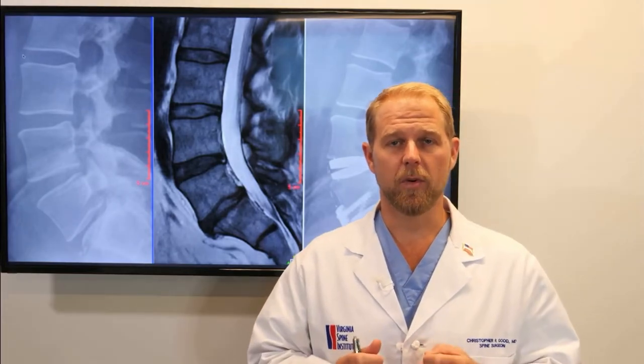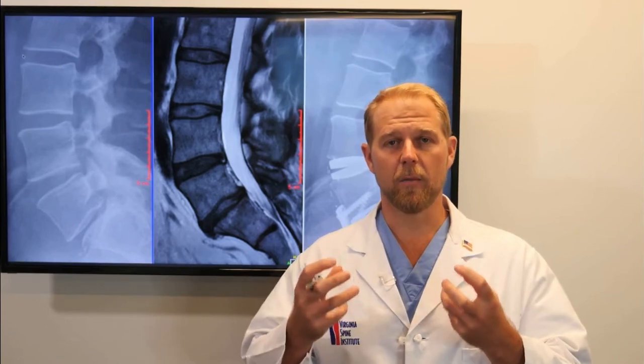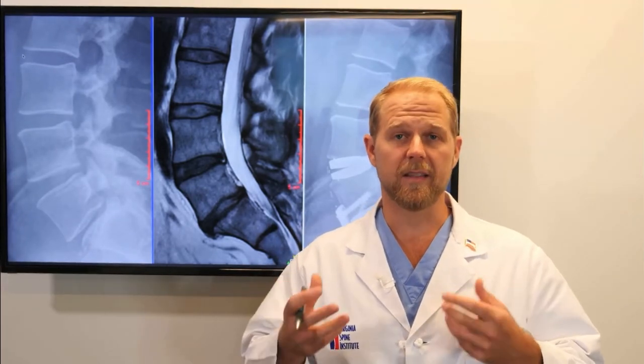I'm going to share with you an example of a combination of a lumbar fusion and a lumbar disc replacement done in the same patient. We call this a hybrid surgery. We all think of a hybrid car — one that can use gasoline or electricity, both, based on what's best at the given circumstance. Being able to do a hybrid surgery allows us to combine the benefits of disc replacement and fusion.